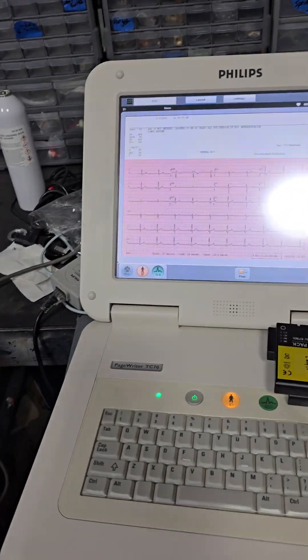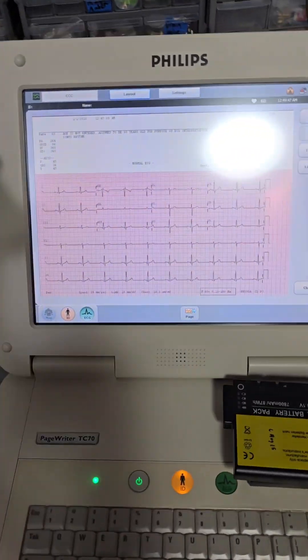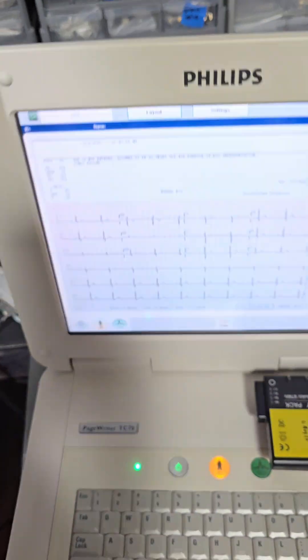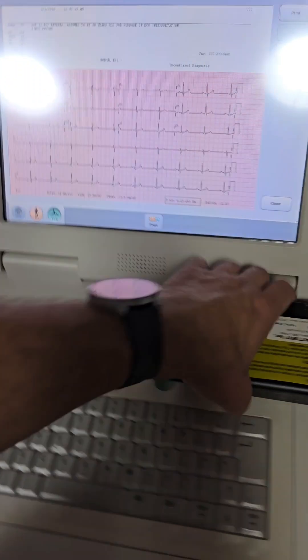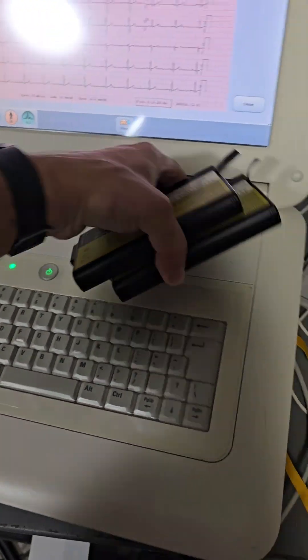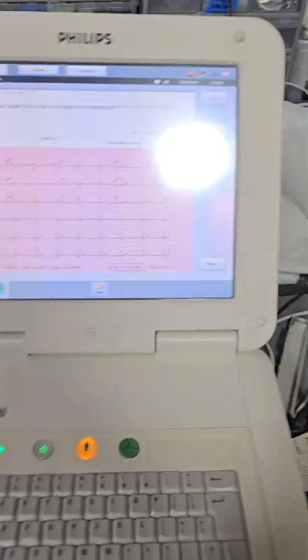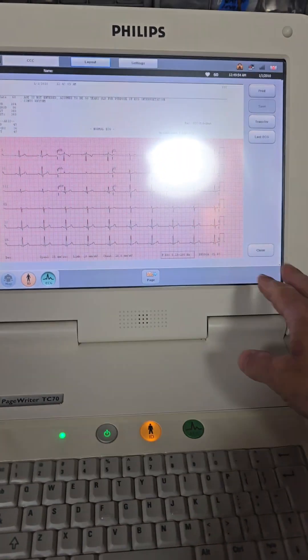This is the PageWriter TC70. I think I did a video on how to disassemble this thing a while back. Let's go to this.